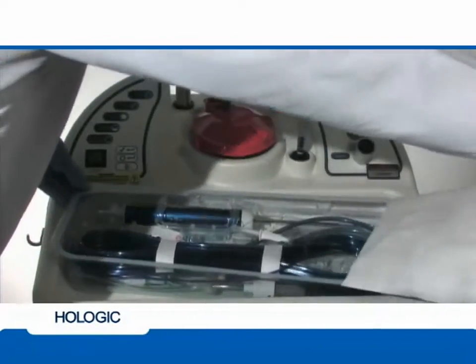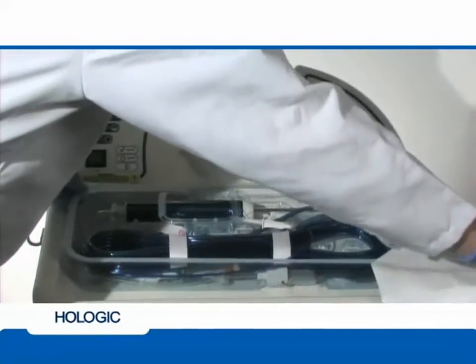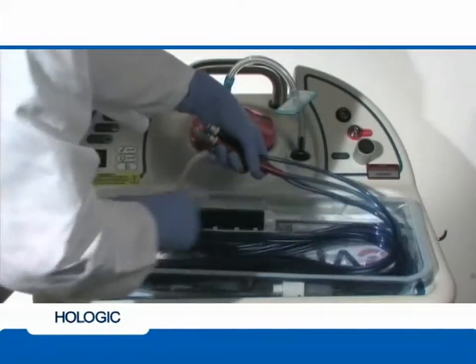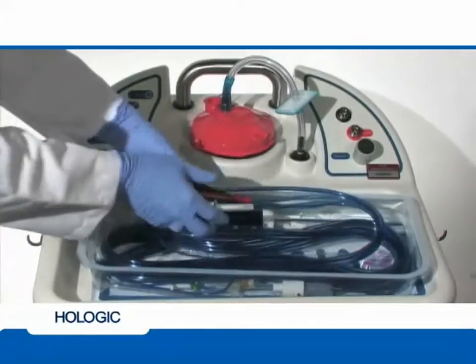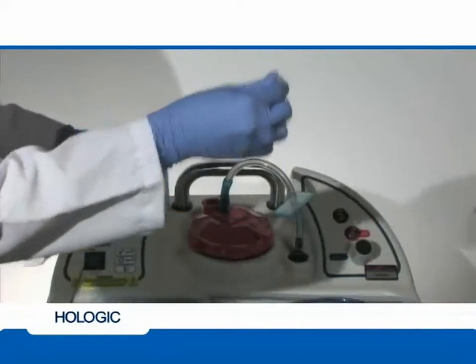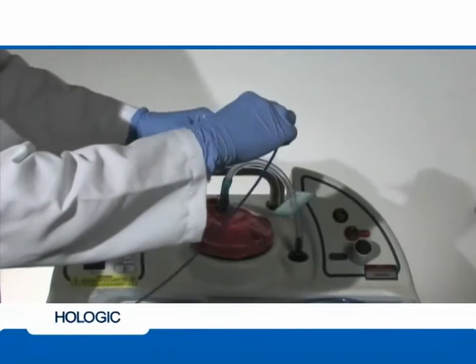Using clean technique, open and remove the Tyvek lid from the tray. Remove the white paper tabs and locate the four connection lines at the end of the Aviva device tubing. Pull the connection lines from the packaging and locate the white capped saline line.